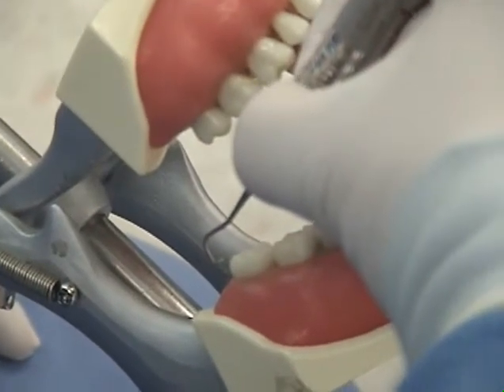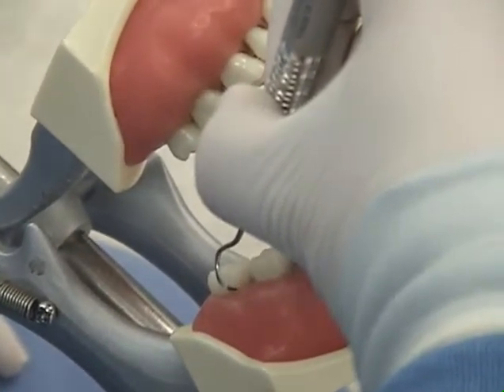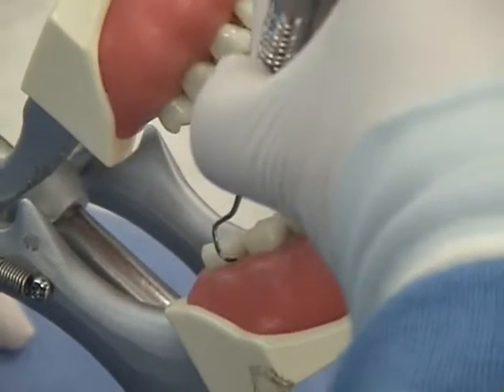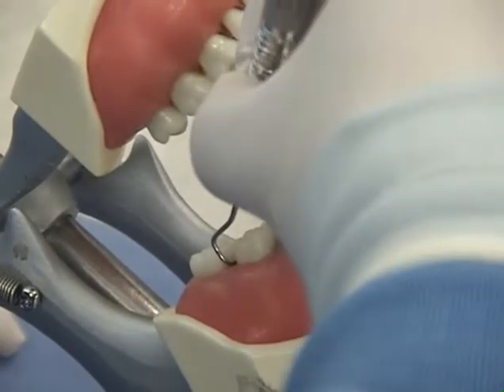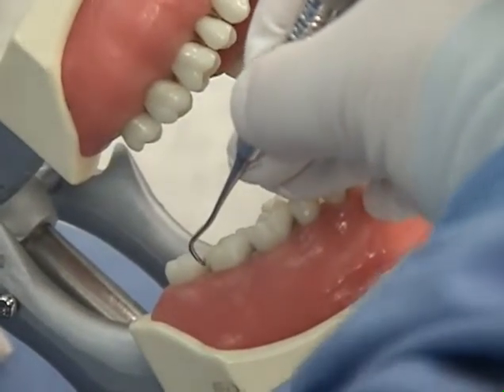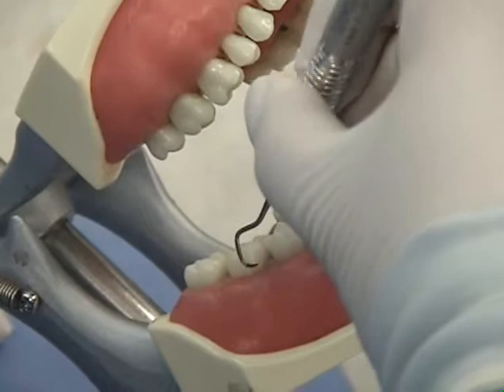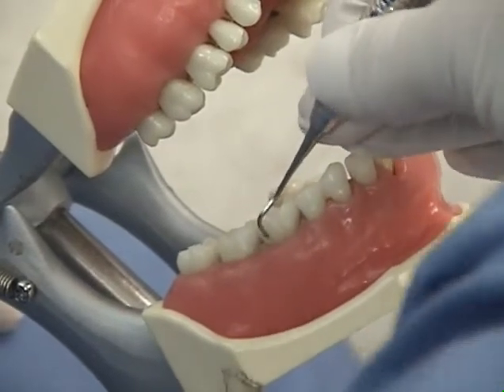You are now ready to instrument the mesial surfaces of the tooth. While maintaining your fulcrum, lift the working end away from the tooth and turn it so that it aims toward the front of the mouth. Reposition the working end at the mesial facial line angle. Tilt the lower shank slightly toward the mesial surface to maintain correct angulation. Work at least halfway across the mesial surface from the facial aspect. Always bring the sickle instrument to the contact before removing. Relax your fingers between each stroke. Continue through the sextant, working toward the front of the mouth completing the facial aspect. Lingual surfaces are scaled in the same manner. Do not instrument root surfaces with the sickle scaler.